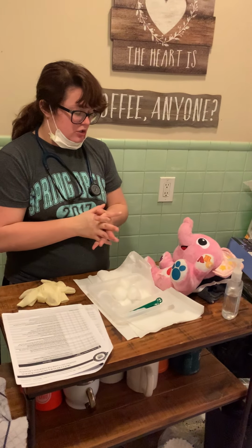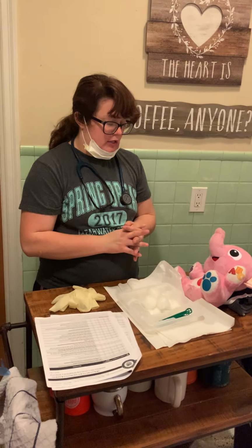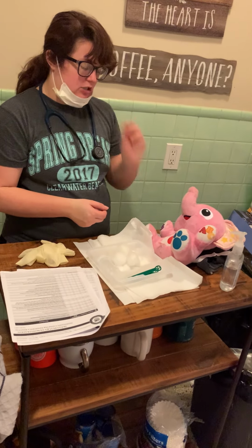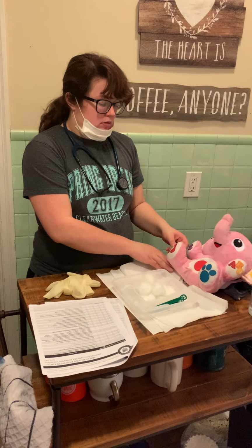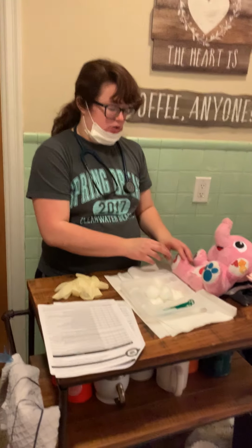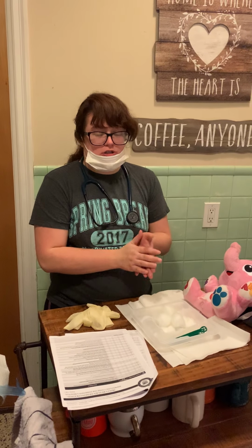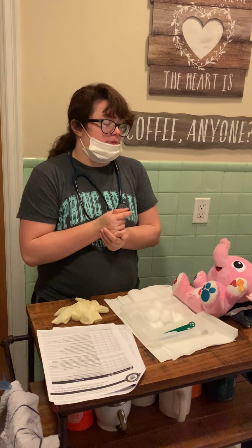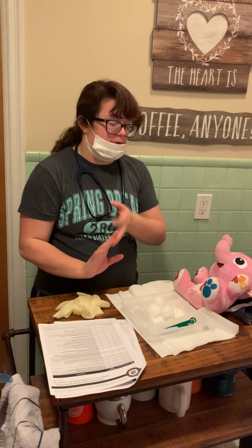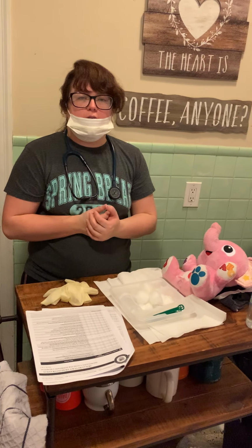You want to make sure that the catheter is taped or secured in place on the patient's thigh, so that it doesn't get yanked on or pulled out when they're moving or repositioning. And then I would let my patient know that I would be back regularly to perform perineal care and prevent any infection that might try to occur in the catheter.